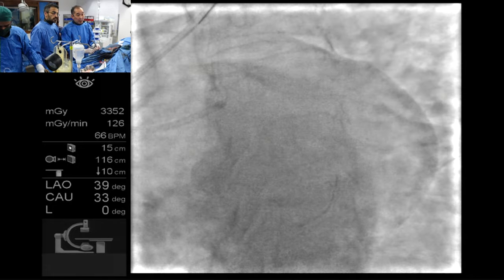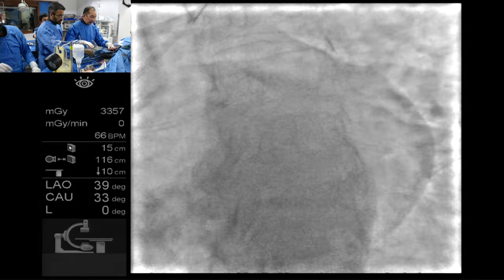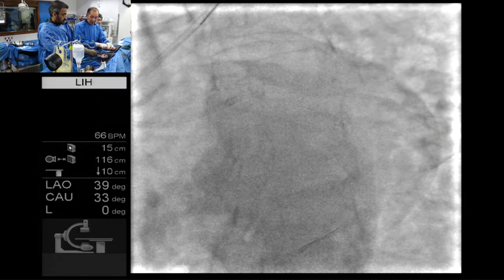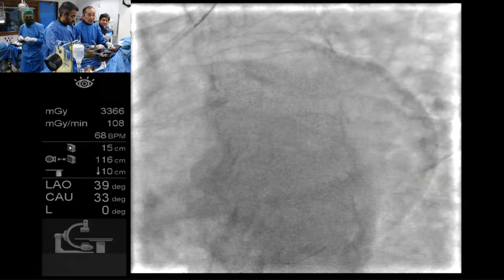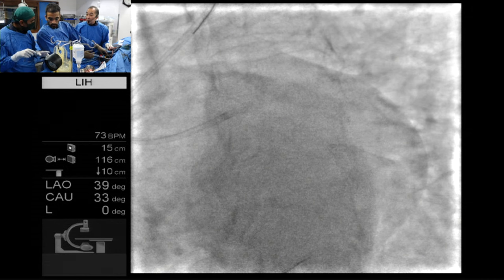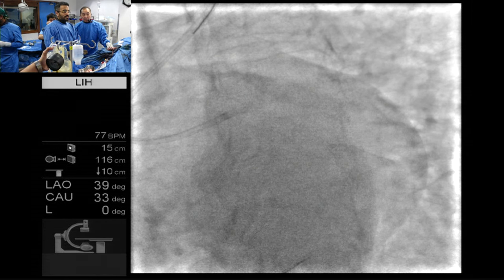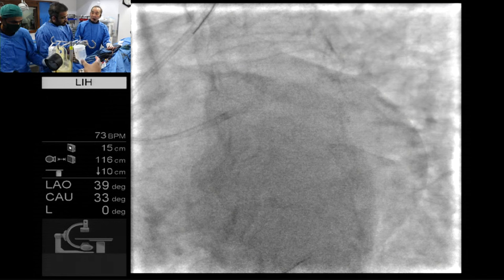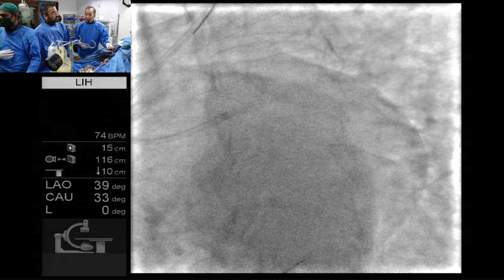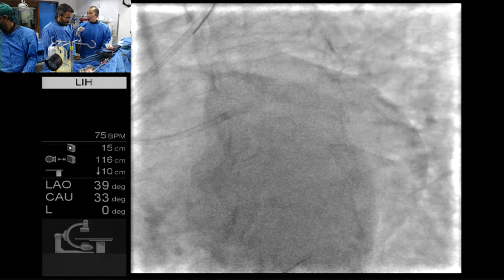So this is all wire bias. So with some little bit change of the wire, the stent can go. I think this is good learning for the fellows. You can see how the wire can help. Okay, I had a 3.5 balloon here. Get a new one. Yes, good. Open that. So after that, I need to recross it and another kissing. So you're making the point of POTing it first before you recross? Correct. That's using the POT now. Make sure it's fully apposed.